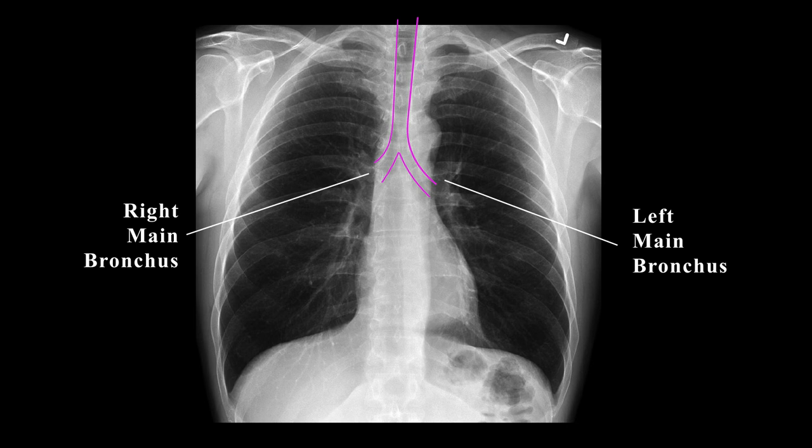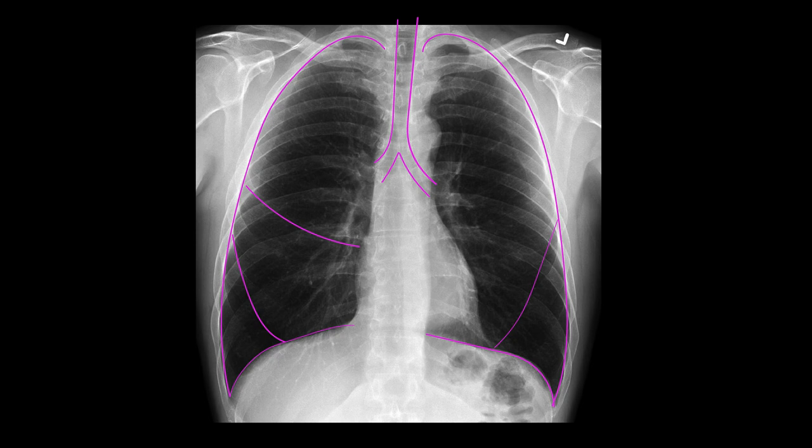Next, you'll see the lungs. The right lung is divided into three lobes by the horizontal fissure and the oblique fissure. The left lung is divided into two lobes also by an oblique fissure.